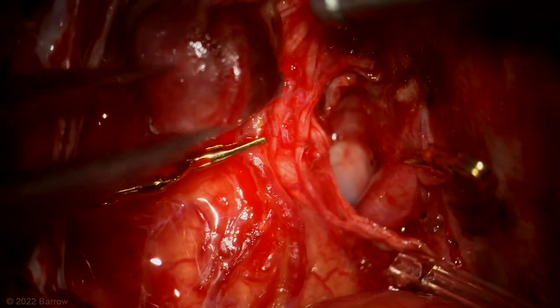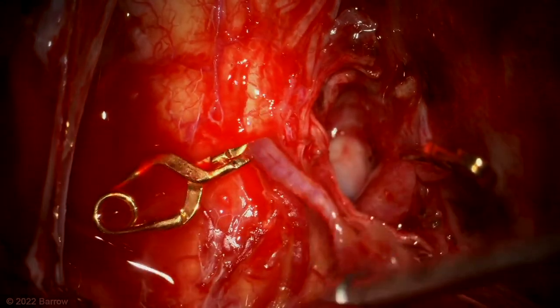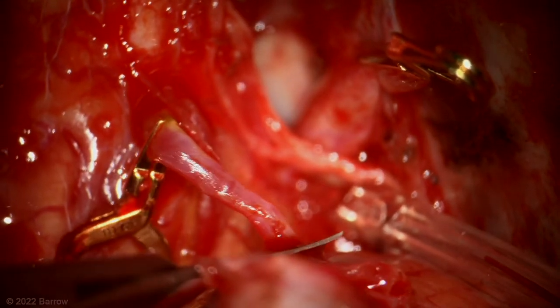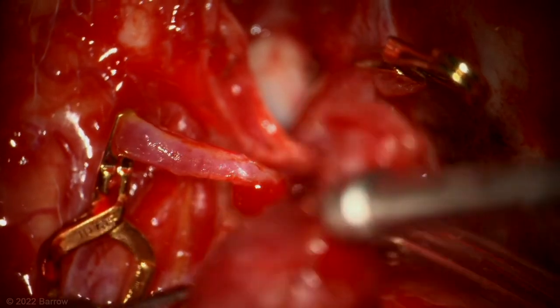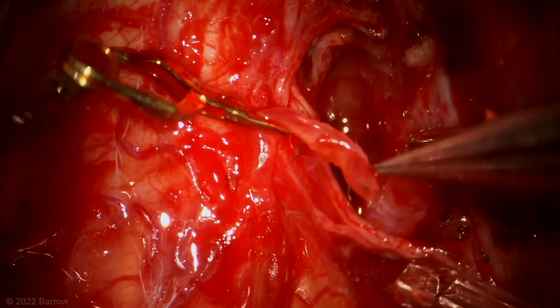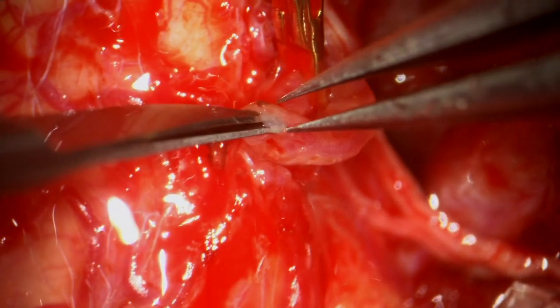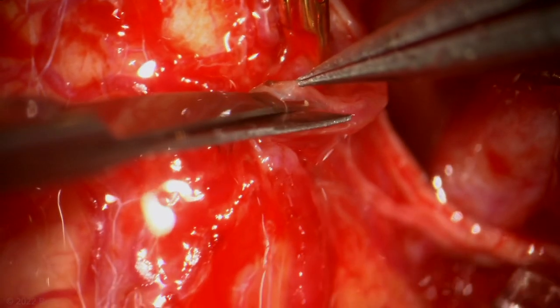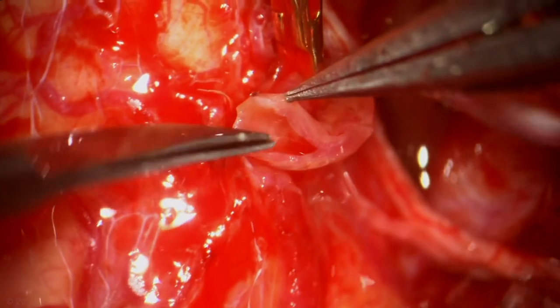The aneurysm is excised completely. The distal end is transected obliquely and fish-mouthed. It's then rotated into position, and there is good redundancy with adequate length to reach the vertebral artery. The fish-mouthing is completed.